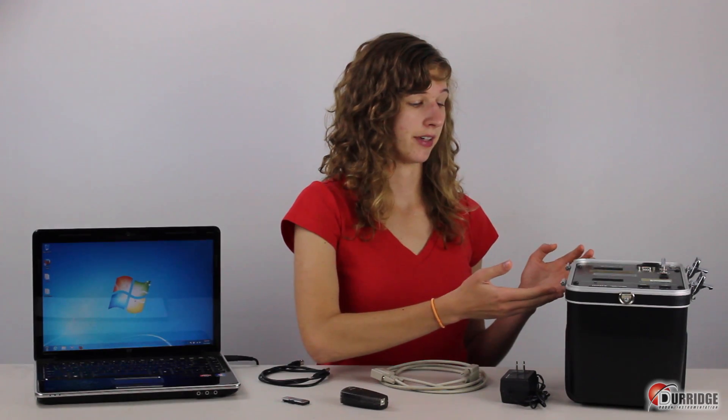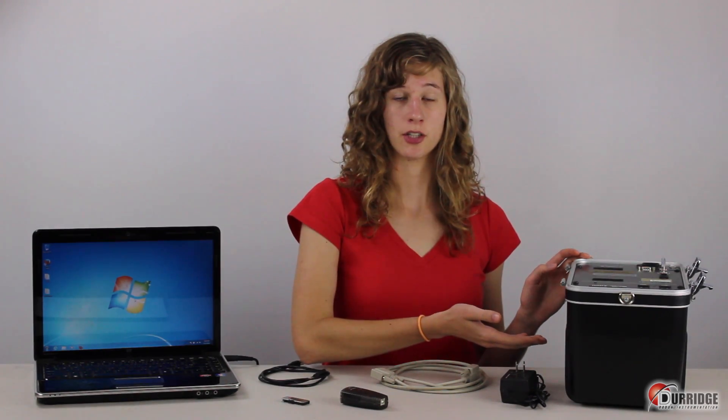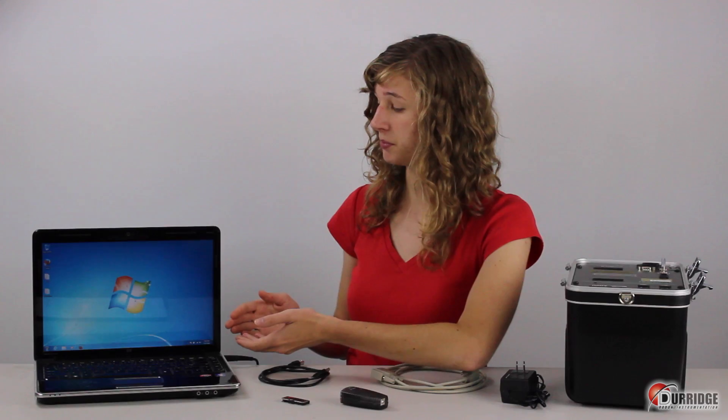You have a RAD7 and you have completed a test. So now you want to download the data onto your computer in order to analyze it with free Durridge Capture software.